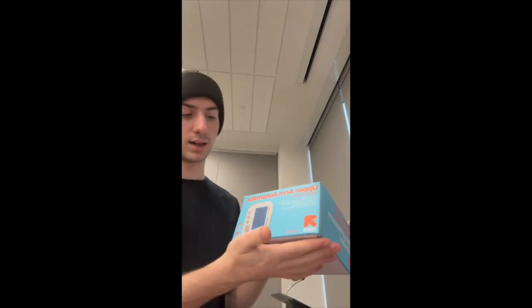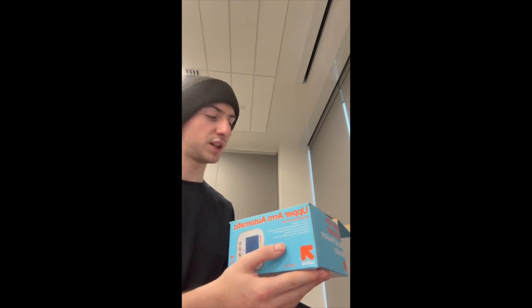Okay, so here we have just a regular blood pressure machine. So the average blood pressure is about 120 over 80 or 90 over 60 millimeters of mercury, which is mmHg. And that's just, it's like centimeters. It's just a way to measure it. That's the measurement for that. So again, it's 90/60 or 120/80. That's the average.